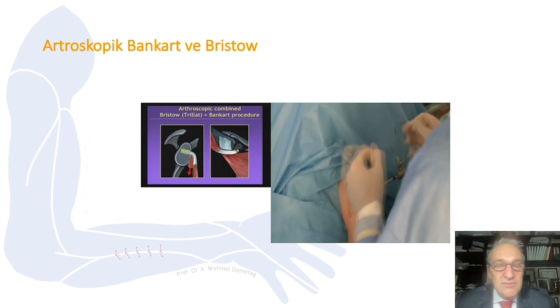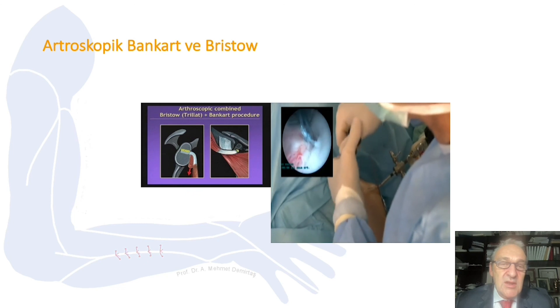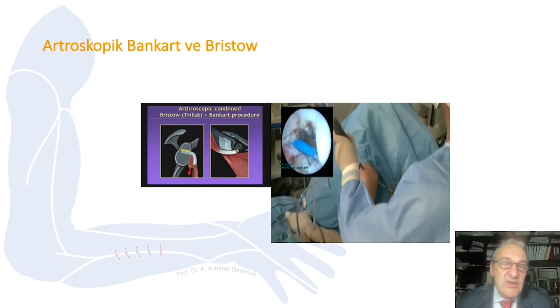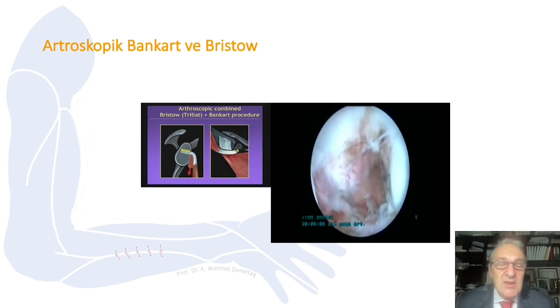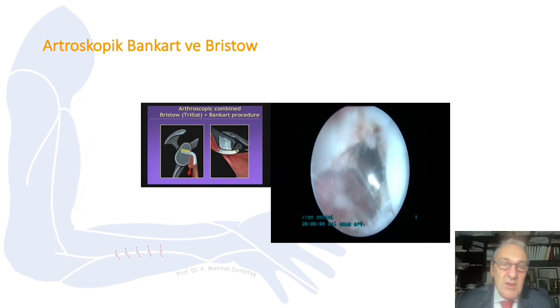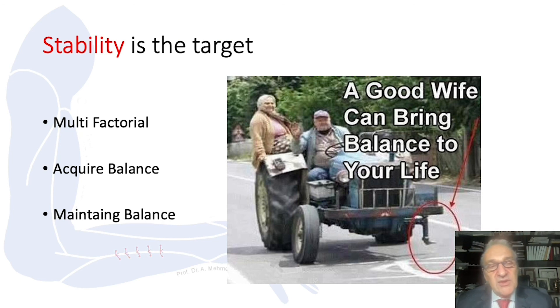The soft tissue repair alone is not enough, so I also want to add a bony component. After tightening the soft tissue, I clean the anterior glenoid rim where I will place the bone graft — first shaving it, then cleaning with radiofrequency and a burr to refresh the cortical bone. Then I place the bone graft over there. Our target is stability, which is multifactorial — we need to acquire and maintain the balance.